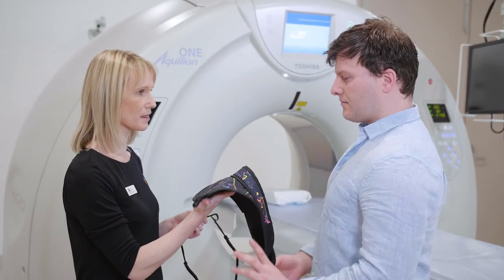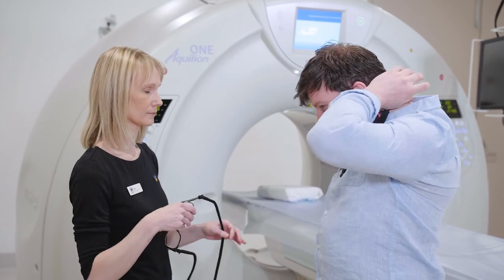At Victoria House we have a really close working relationship with the team at Canon, and we've worked extremely closely to install the scanner, maintain the scanner, manage the applications, and support the moving of the scanner to a new site.